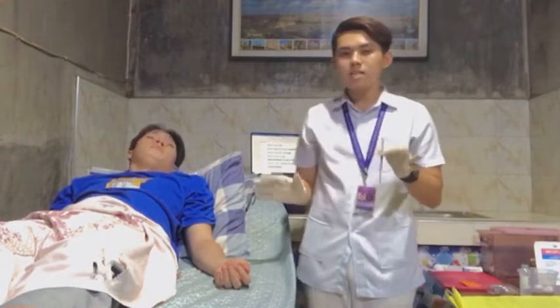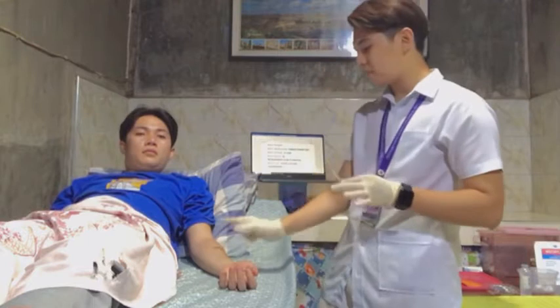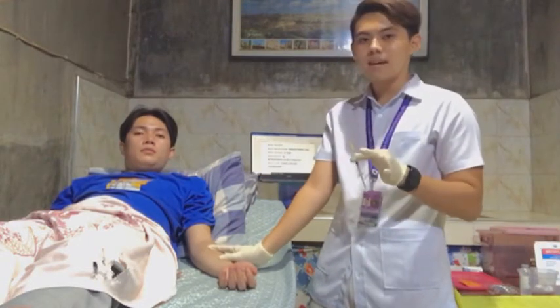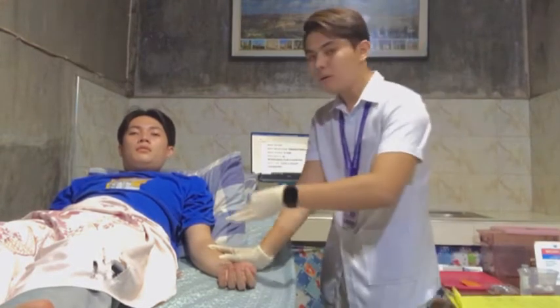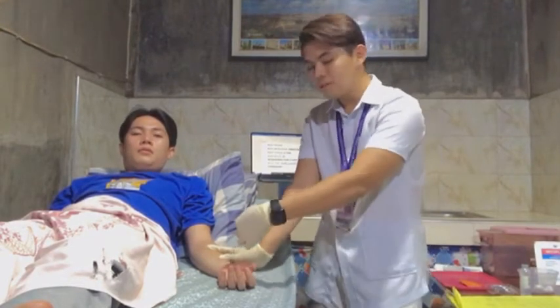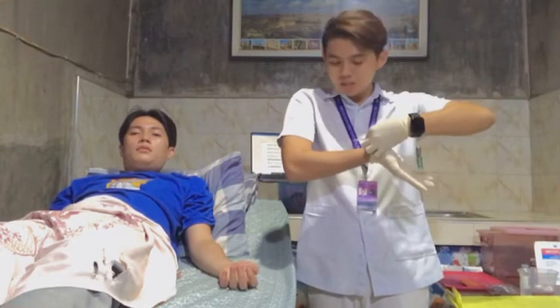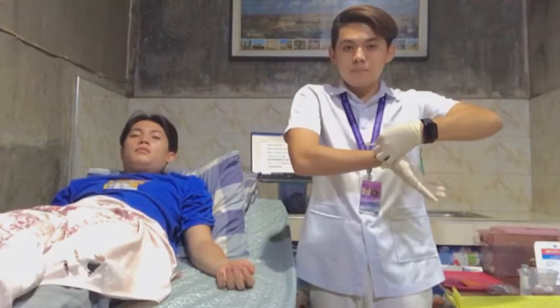Of course, we need to stretch the skin taut at the injection site by pulling gently with the thumb and the forefinger of your non-dominant hand, because taut skin provides an easy entrance into intradermal tissue. So bring the needle very close to the patient's skin and insert it slowly at a 5 to 15-degree angle until you feel the resistance, because intradermal tissue will be entered when the needle is held as near as possible.